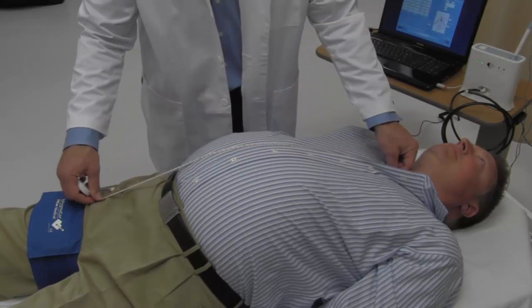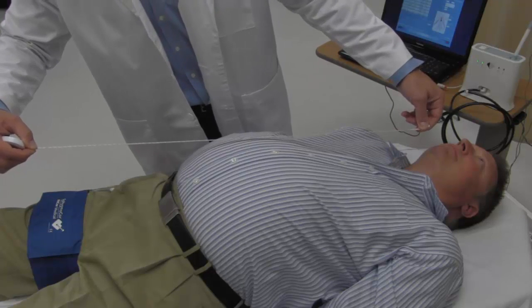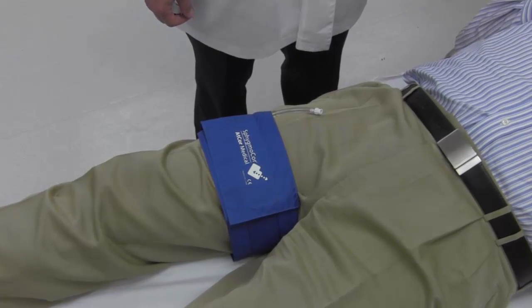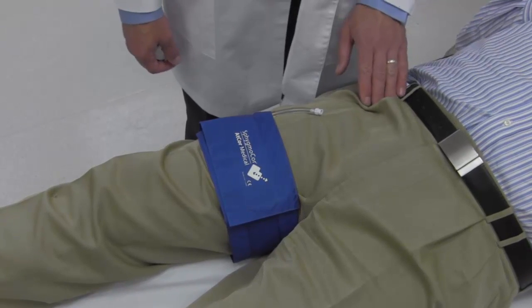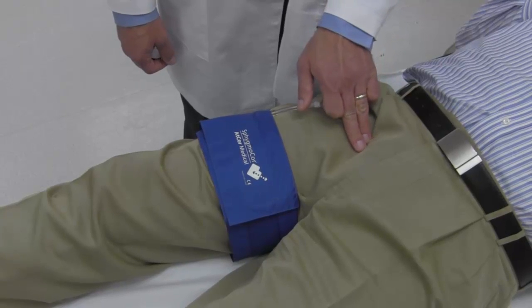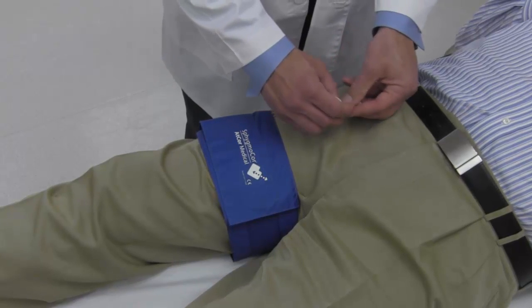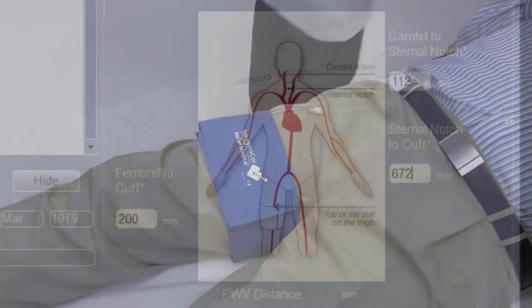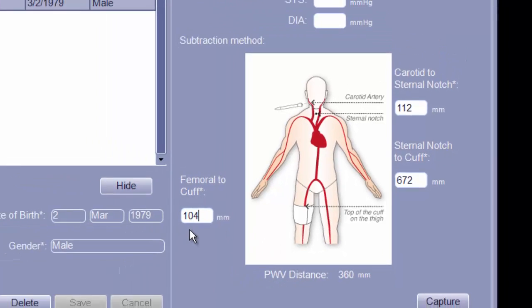For a more accurate distance measurement, lift the tape measure off the subject's body, keeping it in a straight line parallel to the surface the patient is lying on, and carefully measure in this manner. Finally, measure the distance in a straight line from the palpated location of the patient's femoral pulse to the top of the thigh cuff. The femoral pulse is best felt at an angle approximately 45 degrees inward from the hip bone by the groin or crease of the leg. Enter this distance into the femoral to cuff field. Note that it may be difficult to palpate the femoral pulse through clothing, in which case it may be necessary to palpate directly on the skin.